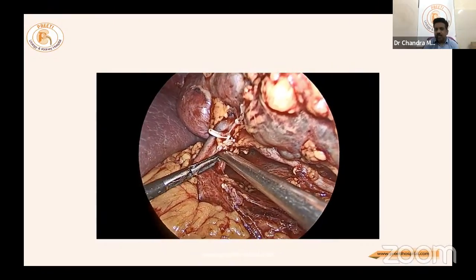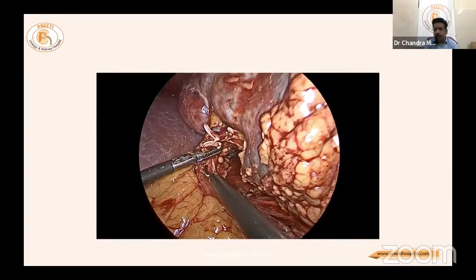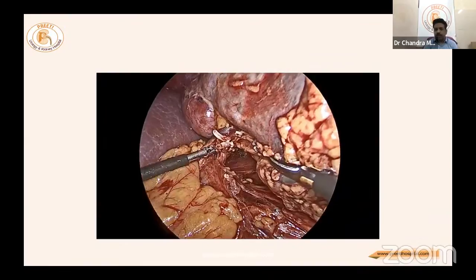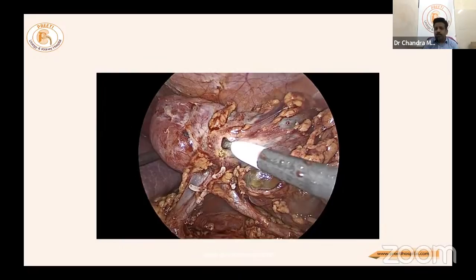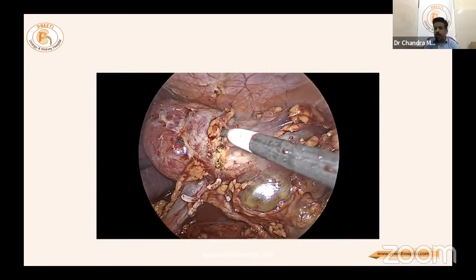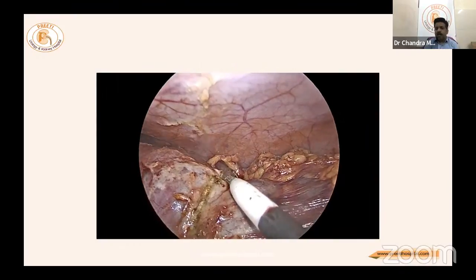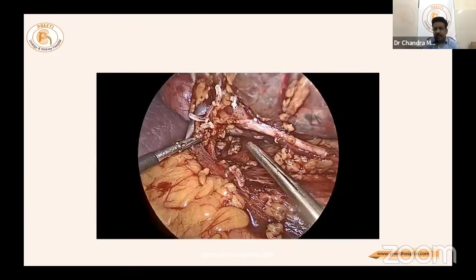The renal artery is now seen very closely aligned with the renal vein. Do not dissect too much — just adequate to place the Satinsky or bulldog clamp. On the left side, the bulldog is preferable. The left kidney is pulled down by one retractor to keep it stable, ensuring all-around parenchyma is visible.